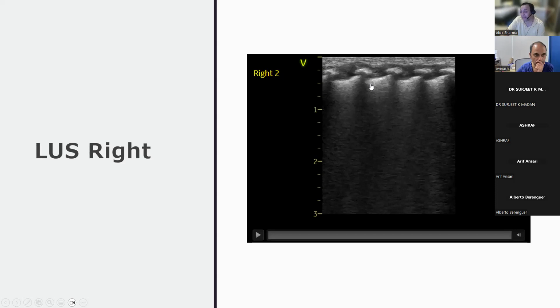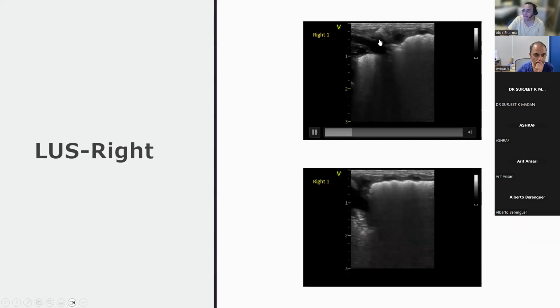And the reason we know it's not fluid is this is later on, after the recruitment. This one, just below the broken pleural line, there is some anechoic fluid. This here, no, that's not fluid. So having done the scan, I can tell you it's probably a little bit of artifact. What you can classically see here is lung pulse. So that's lung pulse.